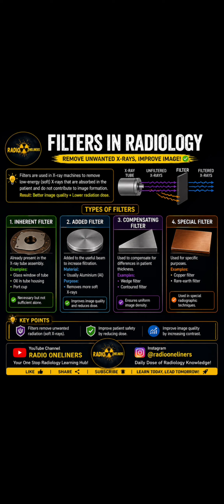As these filters have advantages, it is obvious that they have some limitations too. While these filters do a little bit of a good job by removing low energy X-rays, which are soft rays, additional filtering is required to improve image quality, because these inherent filters are not enough to remove all the unwanted X-rays. We do need extra filtration for that, okay.